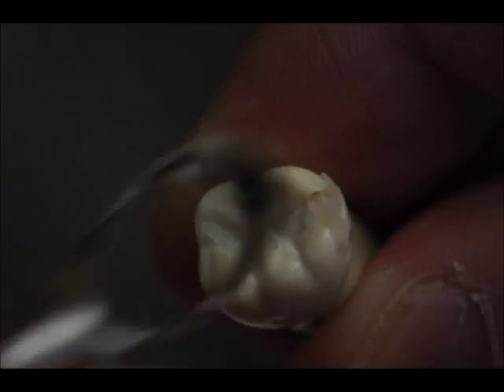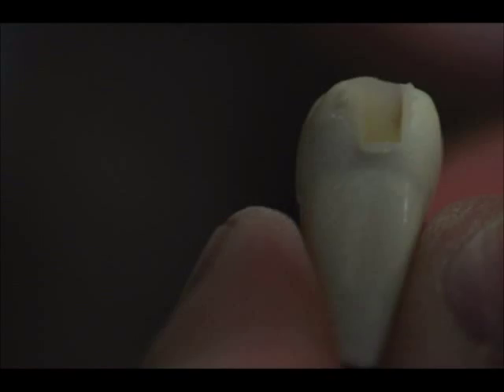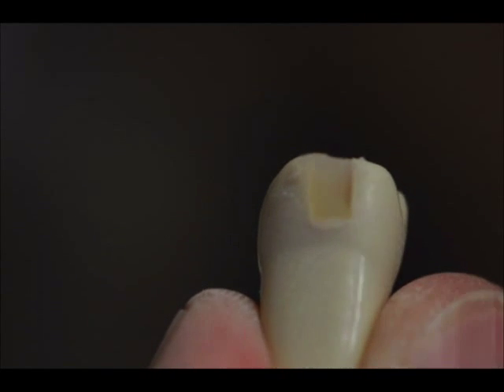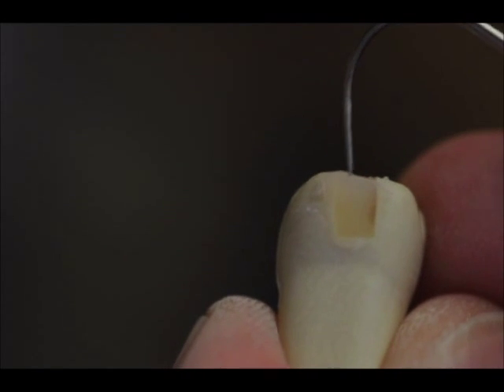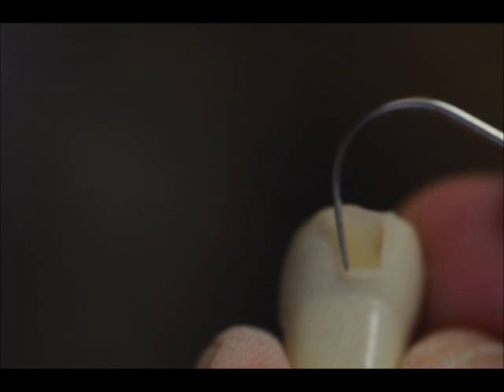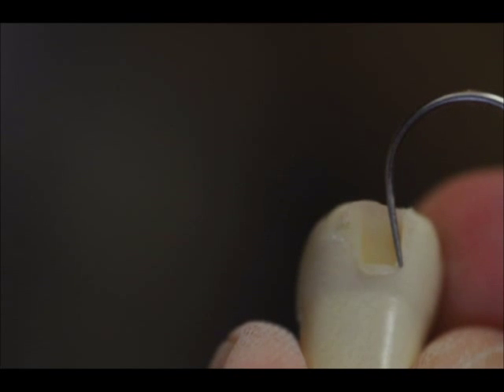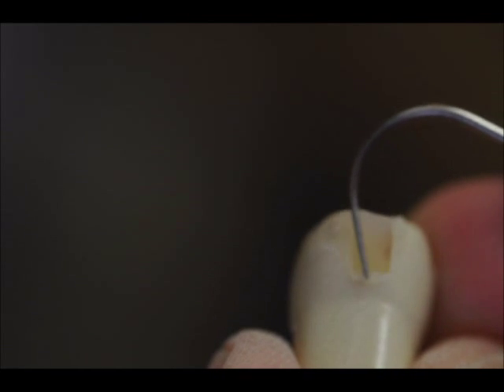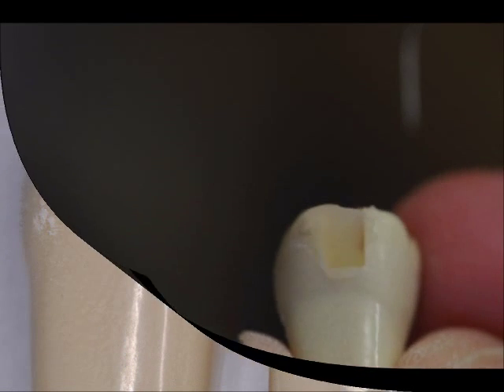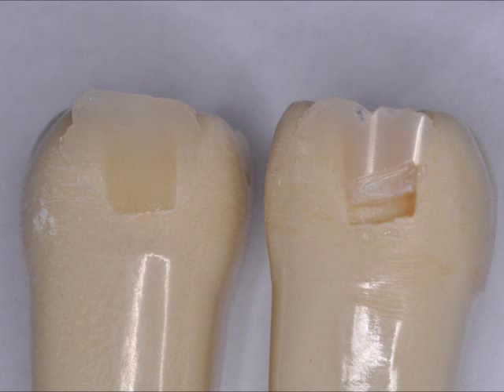However, with this particular composite resin and curing light combination, we are able to cure certainly the first few millimeters of composite resin, and even the depth of the box is able to be adequately cured. This is awesome — it means we can just fill this box up to a depth of four millimeters, which many of our preparations are, and we're good to go. You can compare here: the left side is completely cured and the right side is not.